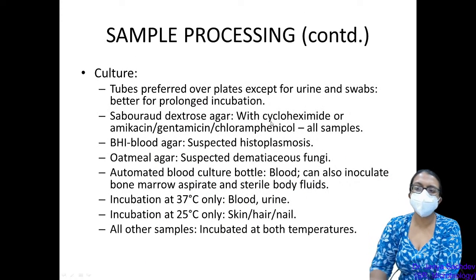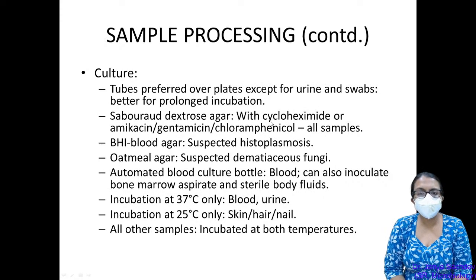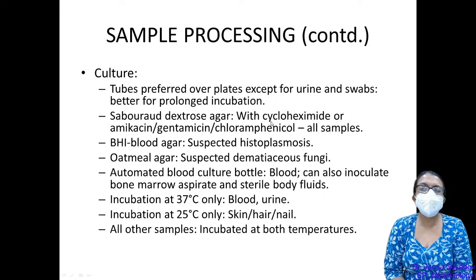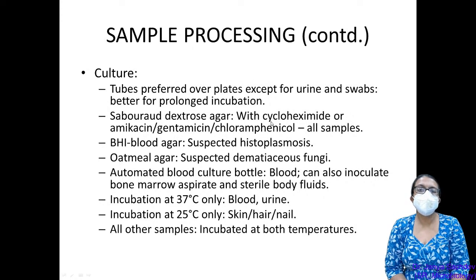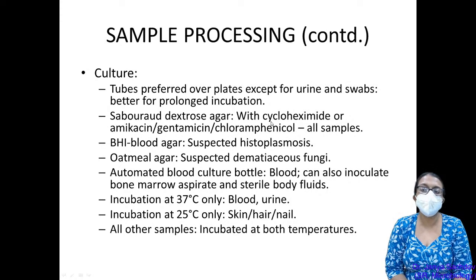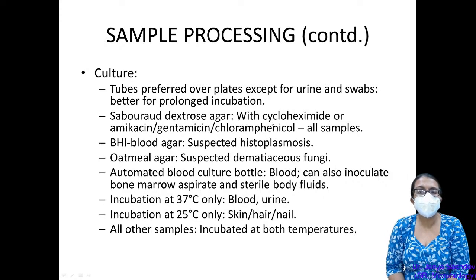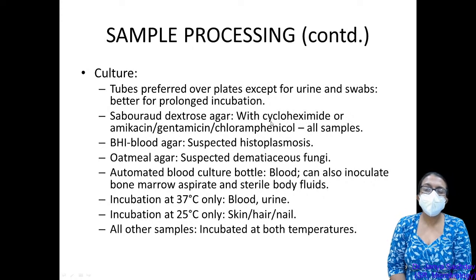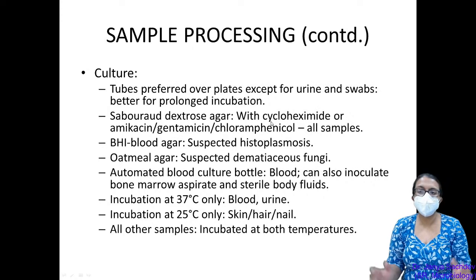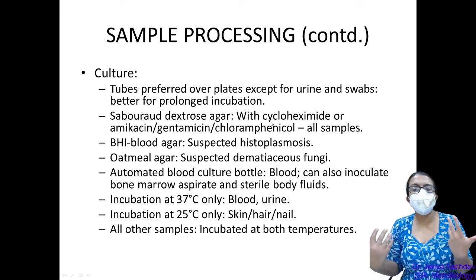So this is an example of showing how direct microscopy can demonstrate different pathogens. Direct microscopy is very important in diagnosis of fungal infections because fungi are slow growing for the most part. Yeasts like Candida may be growing in a few days' time, but there is no fungus which will really give you an overnight or immediate growth the way bacteria will. Also, sometimes fungi may not grow in culture at all. For example, zygomycosis has a very poor rate of recovery in culture. Or suppose the patient has a long-standing infection, or has had some treatment previously, the fungi may not then grow in culture.